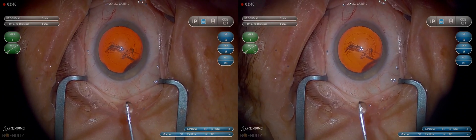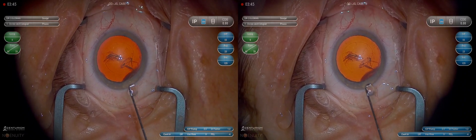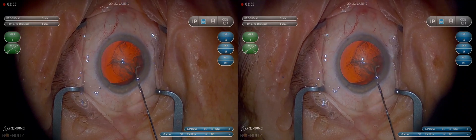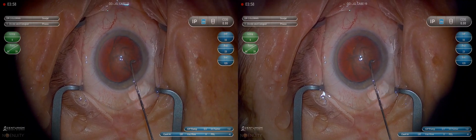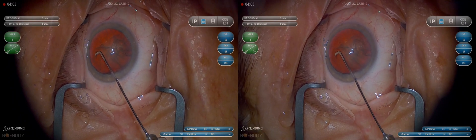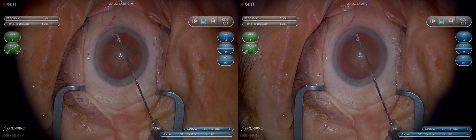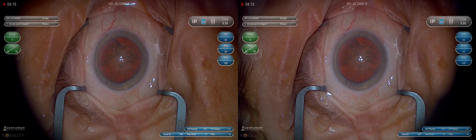For hydrodissection, I use a Chang cannula — a straight cannula is fine, but the Chang cannula is a little better at getting under the wound. We want to make sure that the tip is between the anterior capsular leaflet and the cortex, and not between nucleus and cortex. I don't think hydrodelineation has much value; we want a real hydrodissection between the capsule and the lens. Hydrodissection is about high pressure and low volume — pulses of high pressure. High volume is what burps the lens into the anterior chamber and prolapses the iris through the wound, so high pressure and low volume in small pulses is the key.